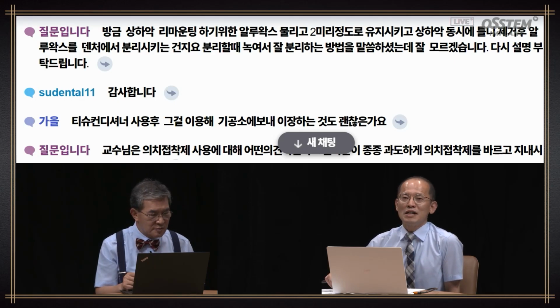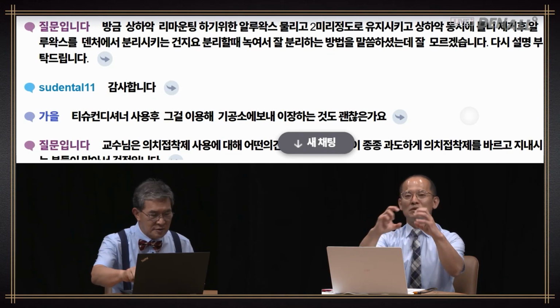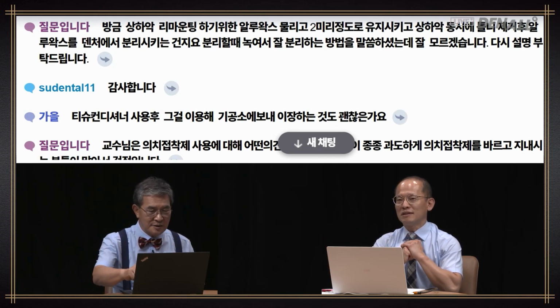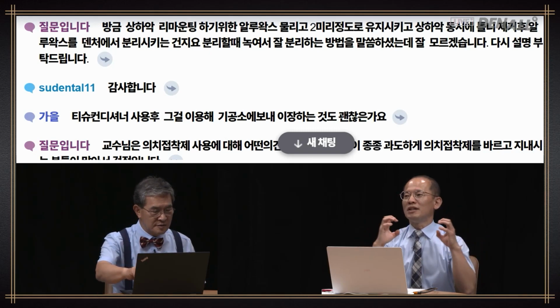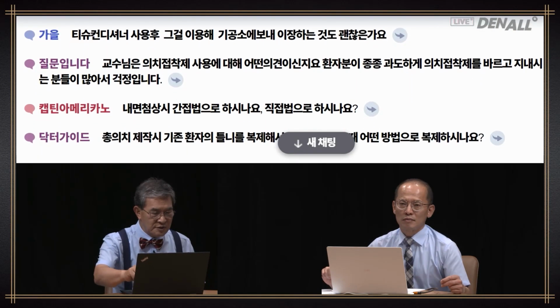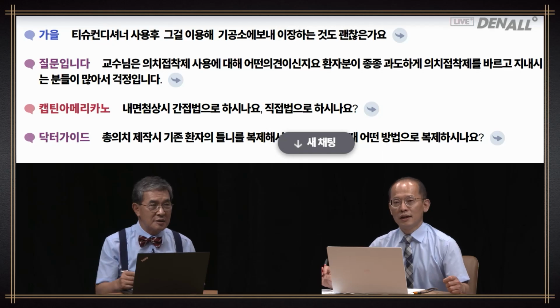And I think I already talked about how we move it together. Because you melt it and attach it again. Remove it together. So with the bite, if there's a separation of the maxillary and mandibular sides, there might be error involved. So you have to remove it together. So after using tissue conditioner, send the technician to do the work.